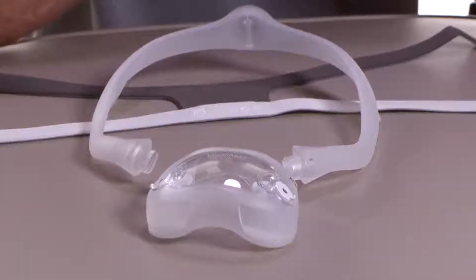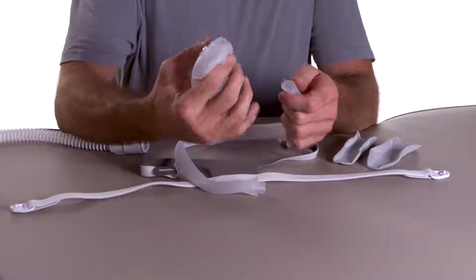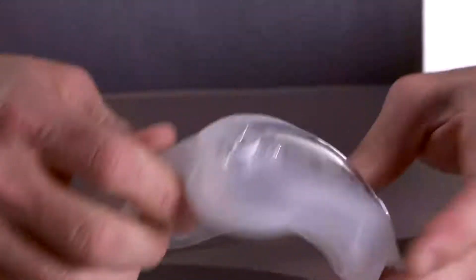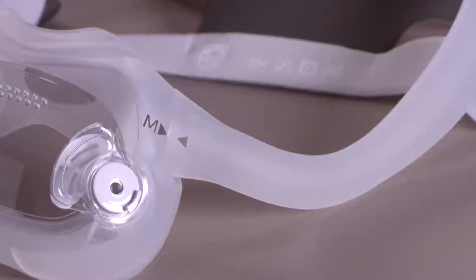Once you've selected a size, attach the cushion to the mask frame by resting one edge of the frame against the cushion and rolling it into the opening. You should hear it click into place. The arrow on the cushion should align with the arrow on the mask frame.